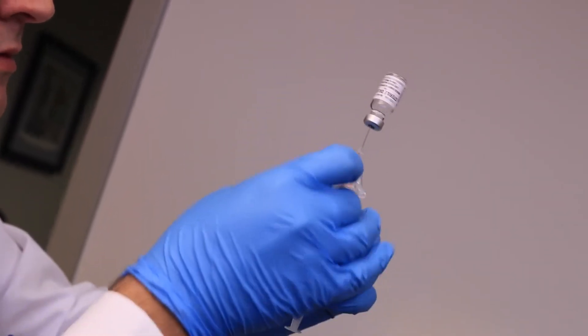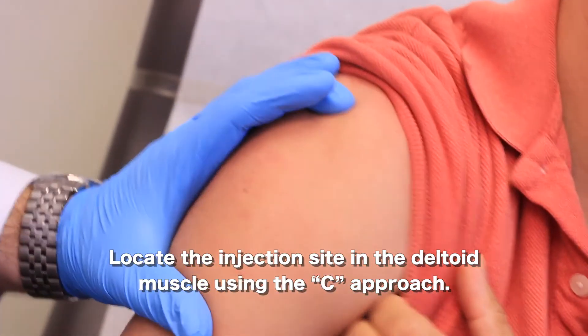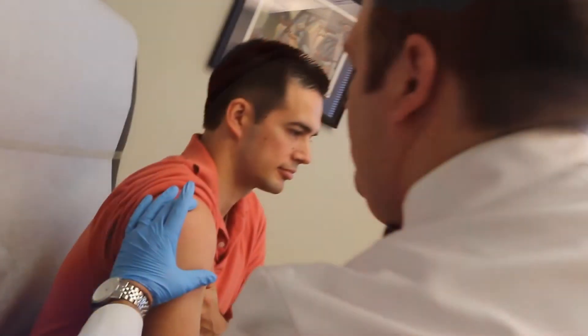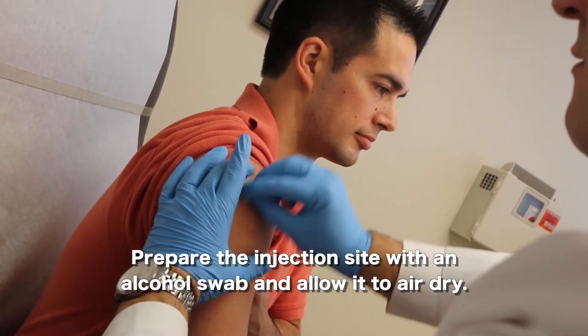The third step is to locate the site on the deltoid muscle of the arm. This is done by making a C-shape and putting the top of that C around the shoulder of the person being injected. You want to select a spot generally above the armpit yet below the shoulder, in the fattest part of the deltoid muscle. Take an alcohol swab and clean and prep that site for injection.